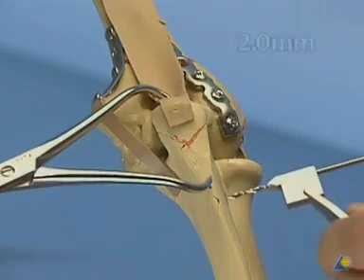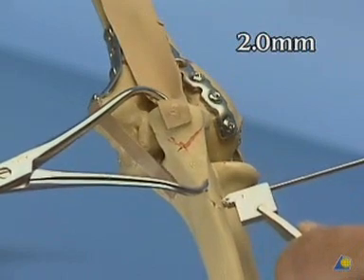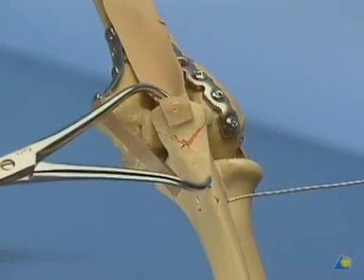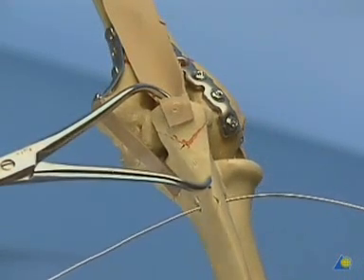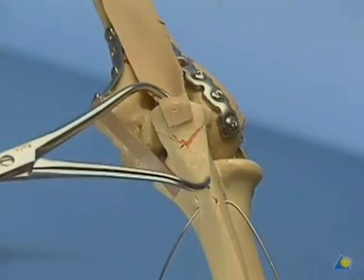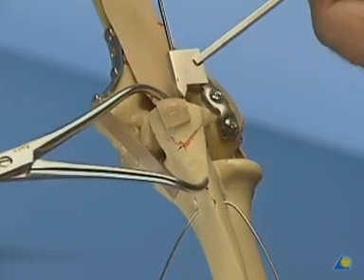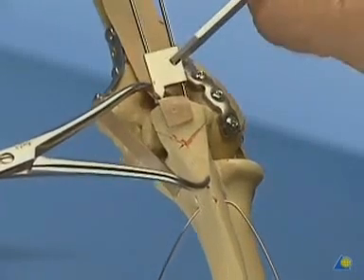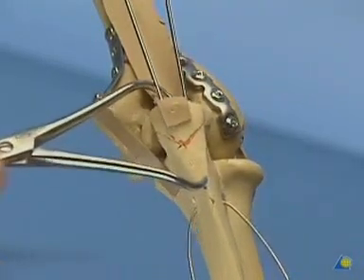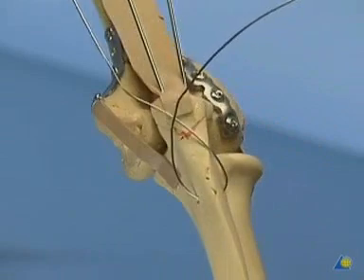First, a transverse 2 millimeter hole is drilled into the ulna, 2 centimeters distal to the osteotomy. A 1 millimeter wire loop is mounted. Two 1.6 longitudinal K wires are placed parallel to each other through the olecranon into the ulna. The figure of 8 wire loop is fastened in slight extension of the elbow and tightened.